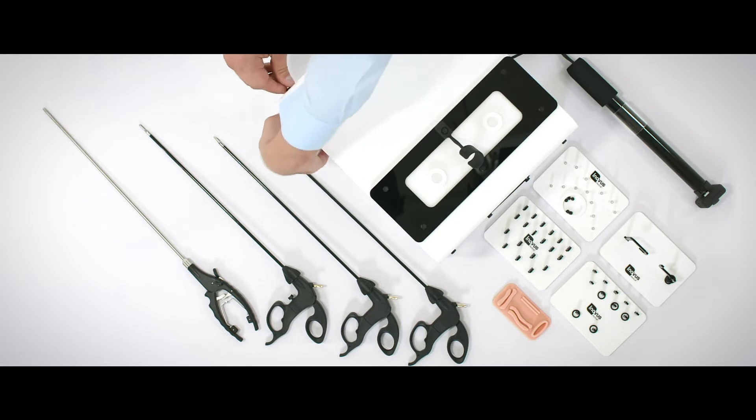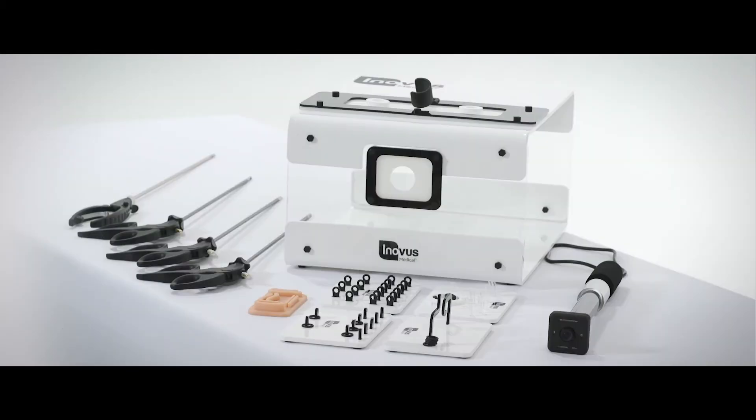To flat pack it, we simply unscrew and screw together the eight bolts at the front and back of the product. This means that the product can be erected or deconstructed in a matter of seconds between uses.